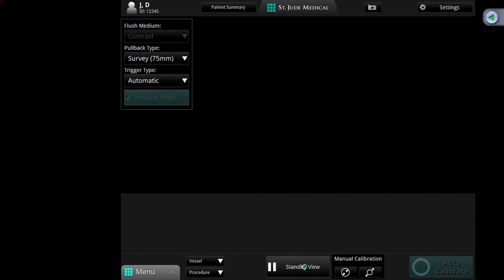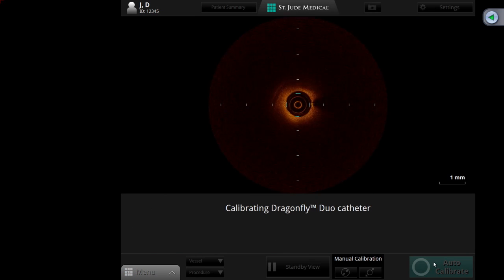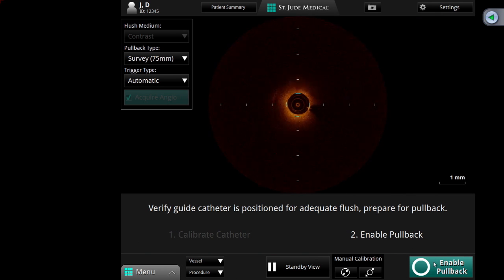Excellent. So I think we're coming back to the point, Samir, in these cases, is there anything different? I would say the difference is I still will follow the BMS data, until we know by our own experience that the specific BVS optimization protocol has eliminated or equaled the stent thrombosis. If we think the patient cannot take DAPT for 1 year, don't put in the Absorb. Right, what is our biggest concern? Knowing that the metal DES is more forgiving than the BVS, until we know that even at 6 months we can stop. I actually had one case last week, where it was not clear whether he was going to take it or not, and we did not put one in. I think that's wise for right now.